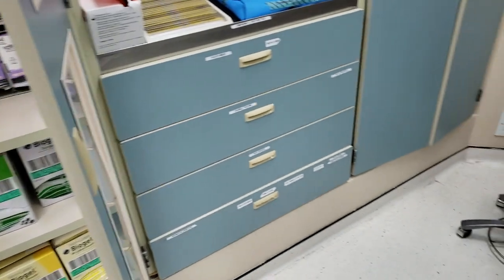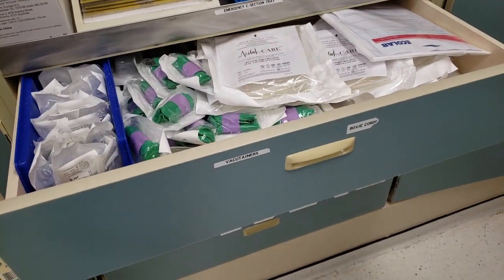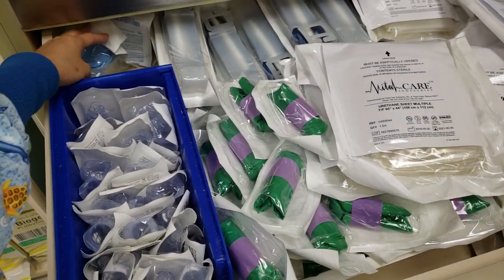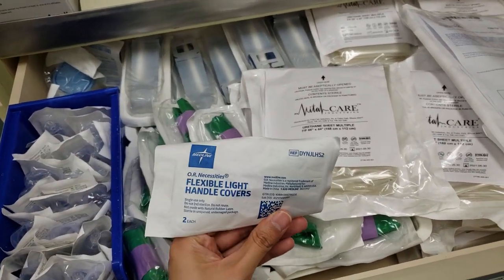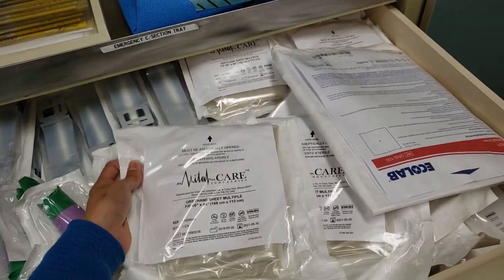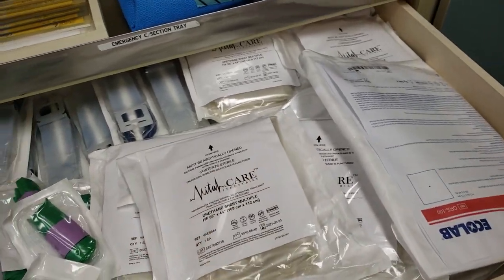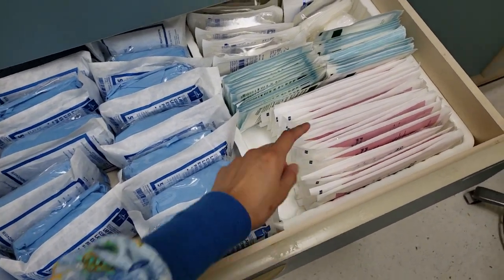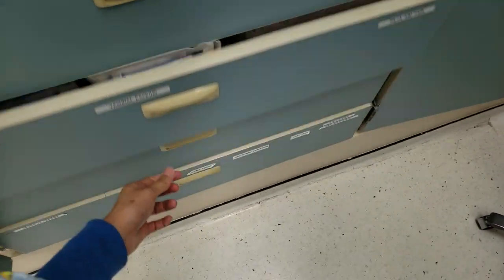And then here we have our drawers of some supplies. You have some vacutainers, some specimen cups, Bovies. These are called light handles. These are the weird ones that I don't like. And then the warmer drape that goes in the other thing. This is also a warmer drape, this is just a different company. And then we have some laps, some ABD, some Telfa, and some packing.